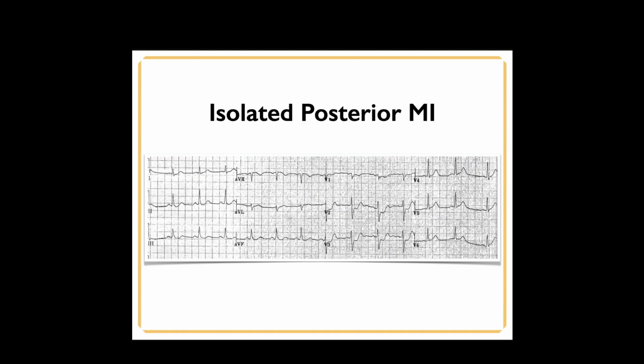a little lecture about how these were missed. And not by the paramedics. I mean, they're probably missed by the paramedics too, but by the ED. So the thing is you have to look for it. You have to say, okay, I'm all done, but is there anything else? And also, if you're really conscientious about going through all the leads and say, is there elevation, is there depression, without jumping to conclusions, you get to the end, you say, oh, I've got depression, doesn't mean anything. And that's how you would probably catch it.